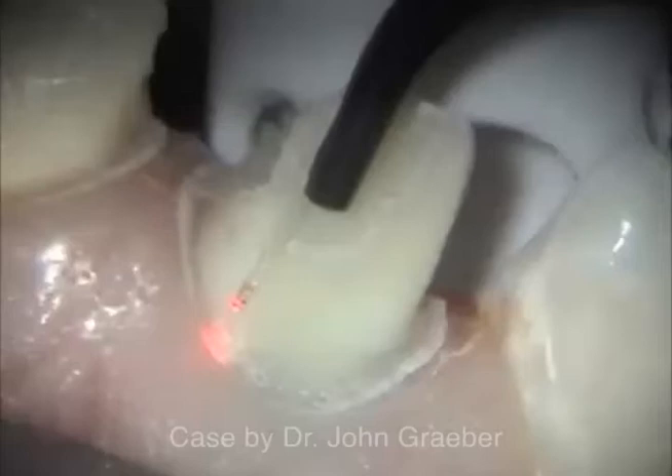One of the most common laser procedures performed is the preparation of gingival tissues for crown and bridge impressions. This video demonstrates how a Pioneer Pro model laser can easily and painlessly create a space between the finish line of the preparation and the gingival collar.